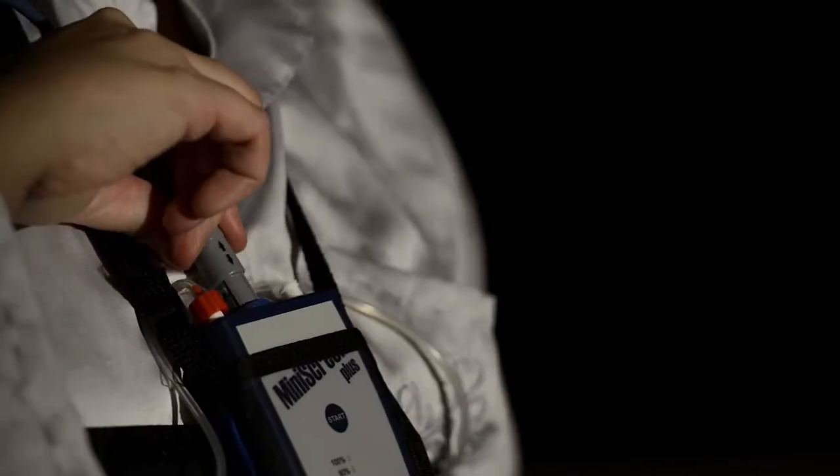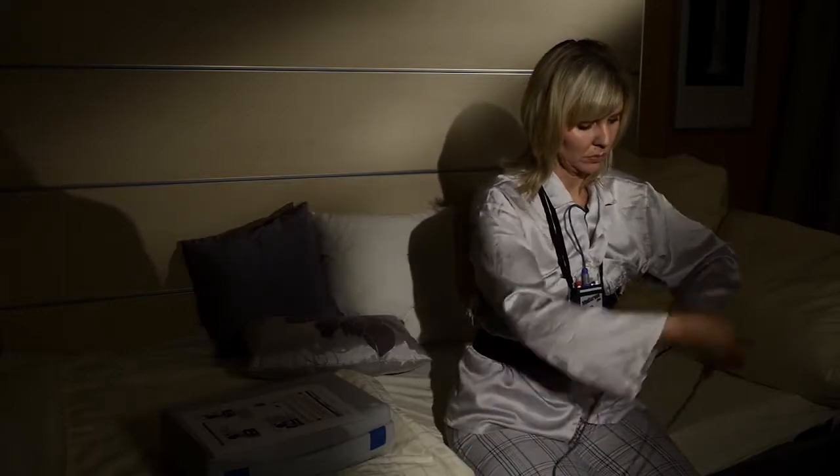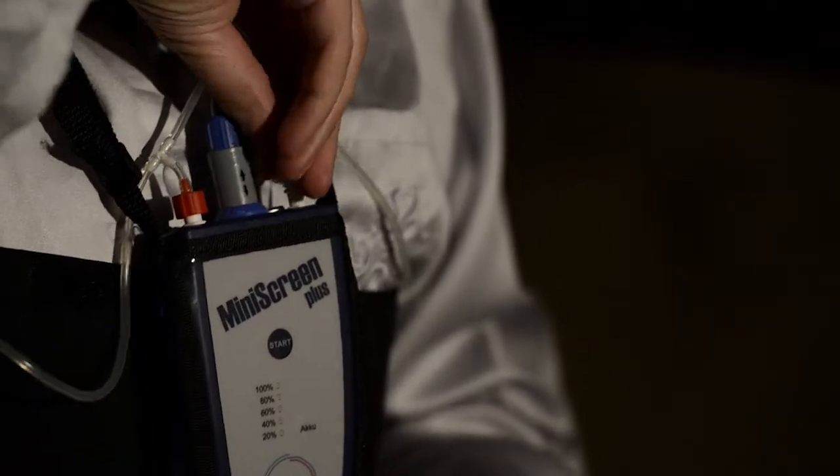The next step is to attach the pulse oximeter in the device and place the index finger in the sensor with the fingernail facing upwards. It measures the patient's oxygenation and pulse rate during the night.